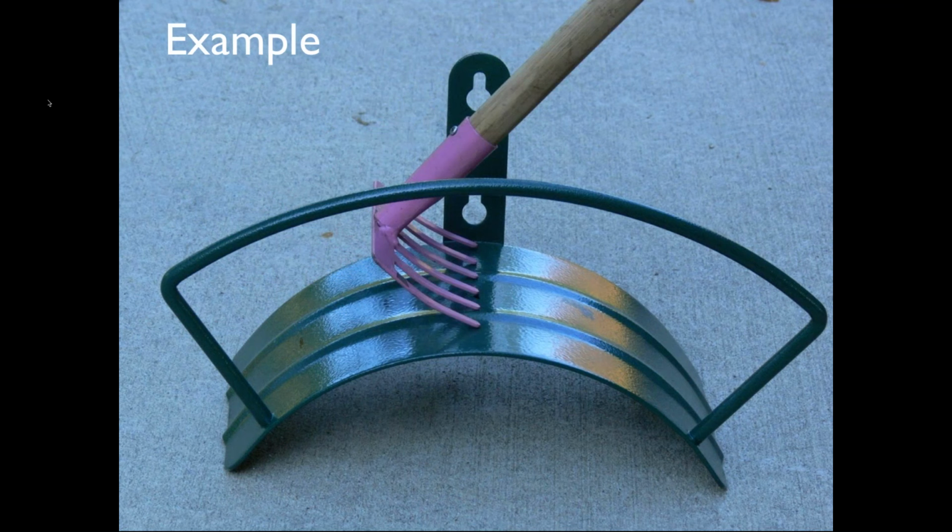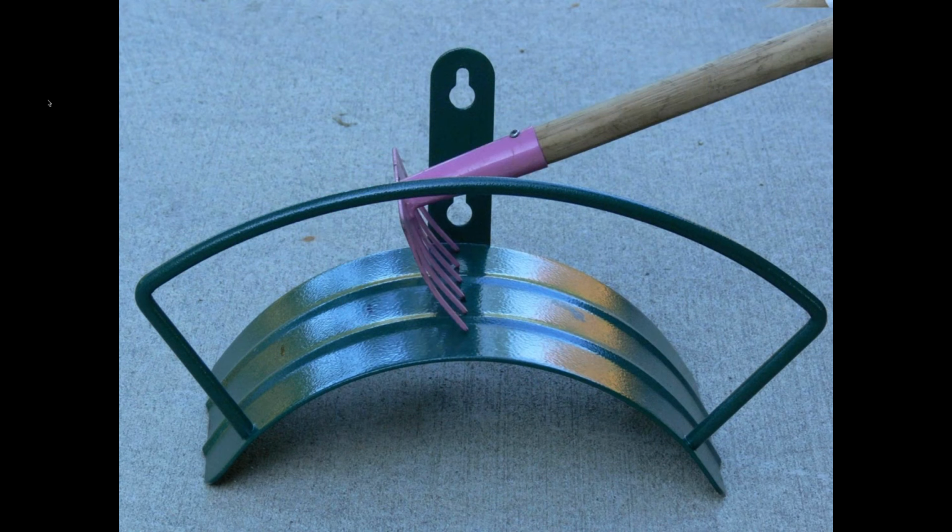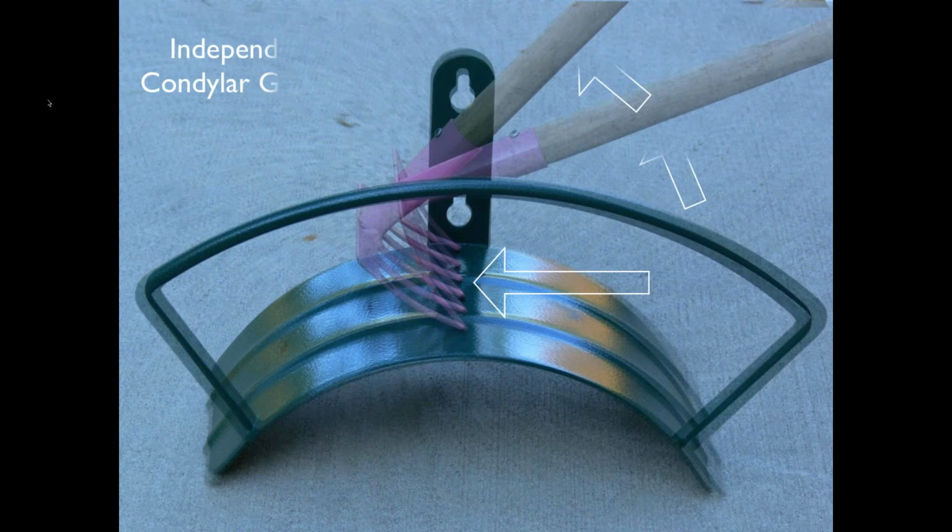And we could call the angle handle the guidance angle, right? So what if we try this again and we lower the guidance angle, we lower that handle down, when we drag those teeth along the path, it follows the exact same path. Nothing changes, right? So whether we have a lower guidance angle or a higher guidance angle, that path of the anterior component doesn't change. Okay, but it does affect what goes on with the teeth because it's never by itself. It's always in conjunction with the posterior guidance.